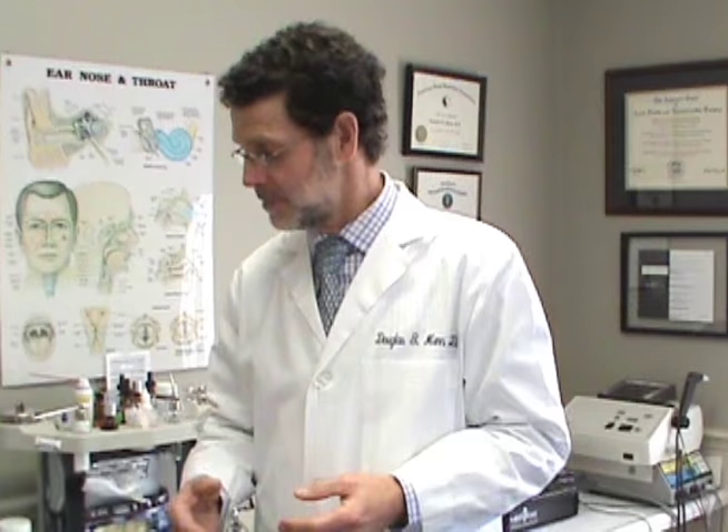Now some folks are able to clear their own ears simply by pinching their nose, puffing out their cheeks and getting air to go in the ear. But some folks just don't know how to do that, and that leads to a situation where you may have difficulty clearing the ears during descent in airplane travel, or they may wind up with fluid in their ears following an ear infection and can't clear it. So the Otovent helps you do that.